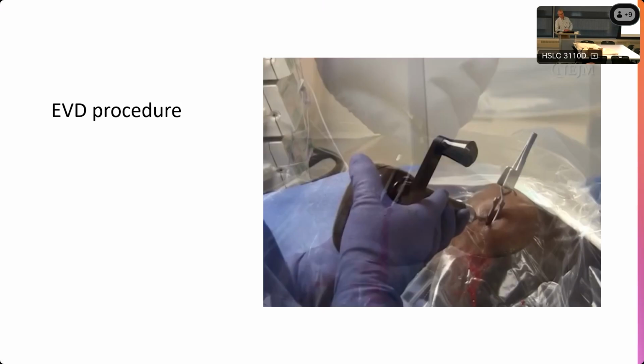We just twist the hub, and it just pulls you in, nice. You're holding the skull still.